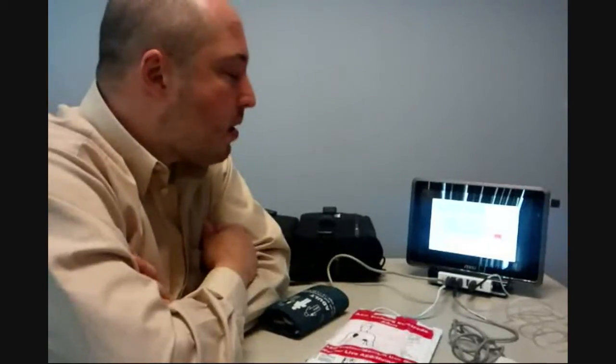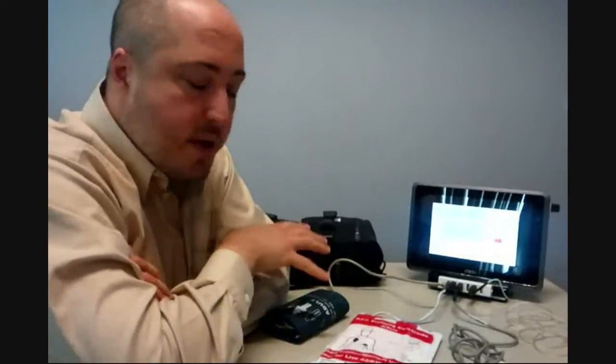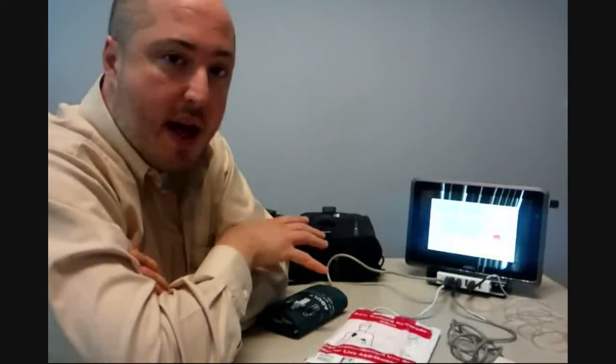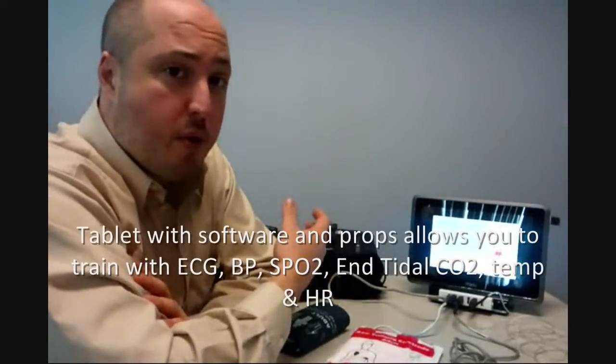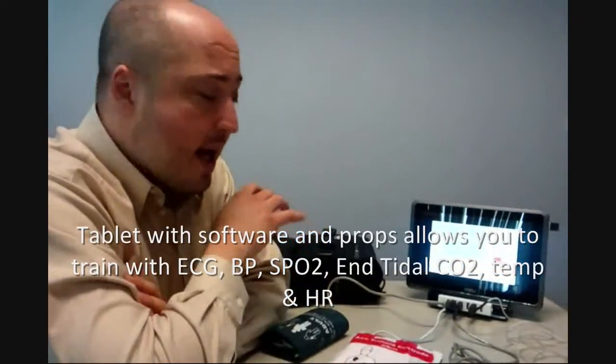It's basically a tablet computer with our proprietary ECG and monitor defibrillator software loaded on it, and it's designed to be used in a classroom for teaching ACLS, PALS, paramedic, or other advanced life support courses.